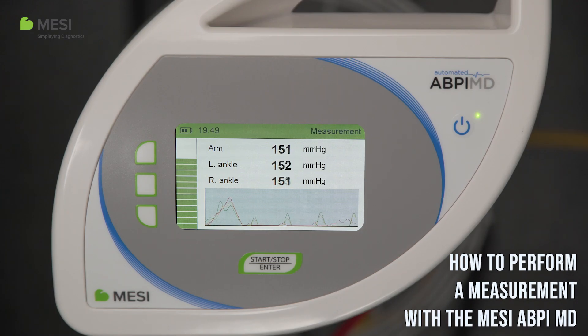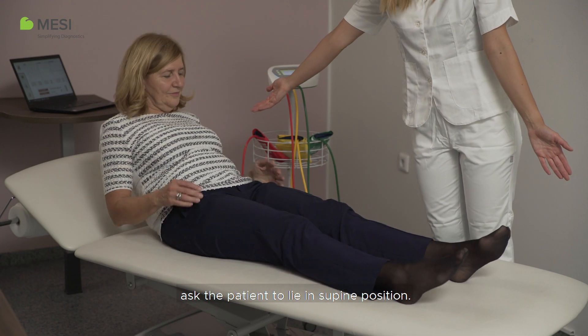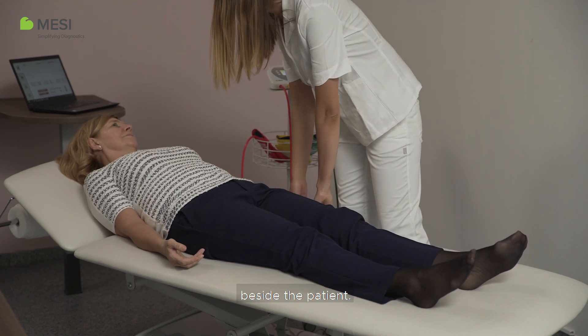How to perform a measurement with the Macy ABPI-MD. For the measurement to be correctly performed, ask the patient to lie in a supine position. The arms must lie relaxed on the bed beside the patient.